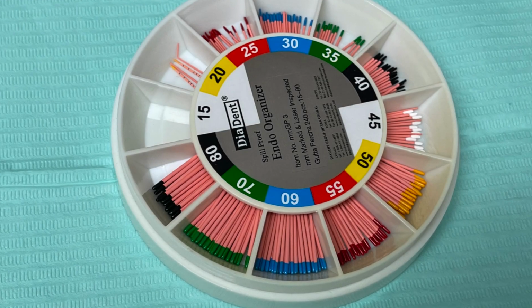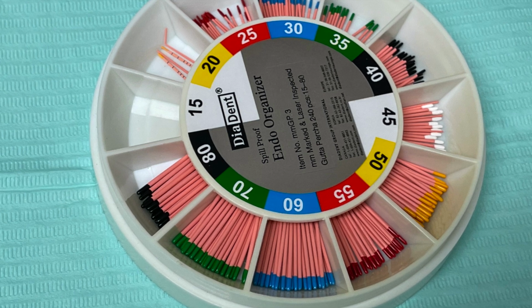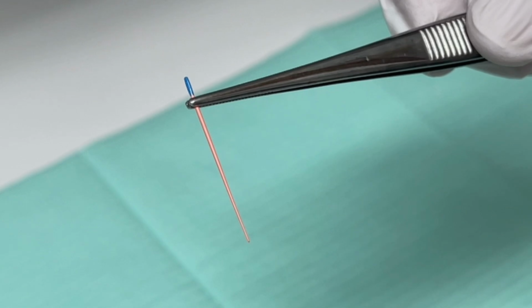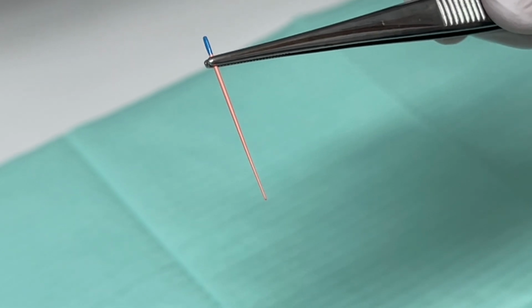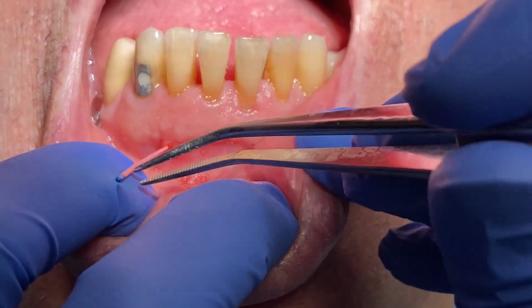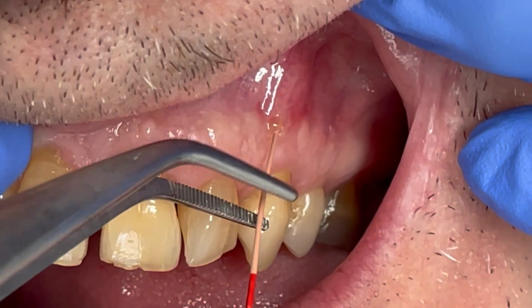In order to identify the origin and pathway of the tract, a radiograph with sinus tract tracing needs to be part of the radiographic examination. This radiograph is often referred to as a sinus tract radiograph or a fistulogram. The most common way to perform a fistulogram is to use a gutta percha point. Choose a standardized gutta percha point of size 25, 30 or 35. Inserting a gutta percha point into a fistula is normally not painful. Anesthesia is rarely necessary, but in some cases, if the patient wishes, feel free to administer an infiltration local anesthesia.